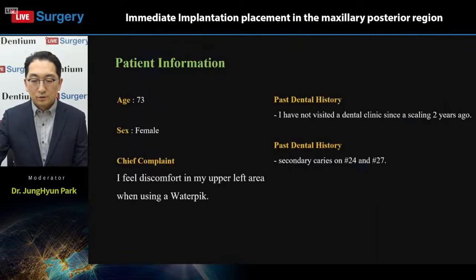Let me first tell you about the patient's information. The patient is a 73-year-old female. She visited our clinic with the chief complaint of discomfort when using a water pick in the upper left posterior area. The left maxillary premolar and molar were connected with a bridge, and secondary caries was observed.